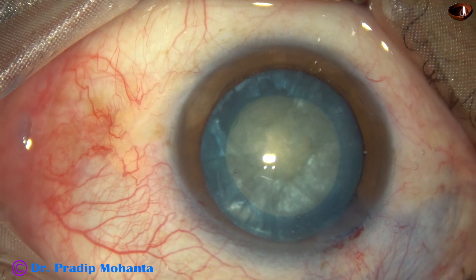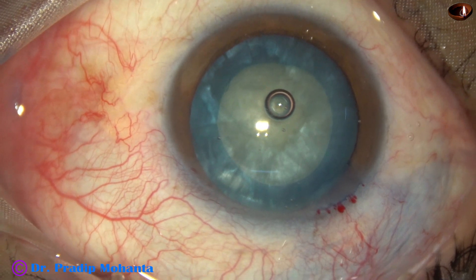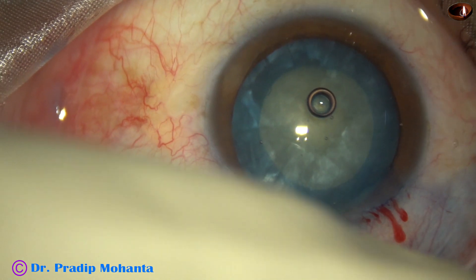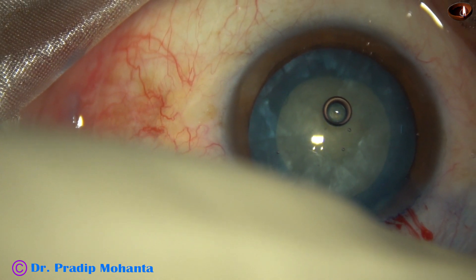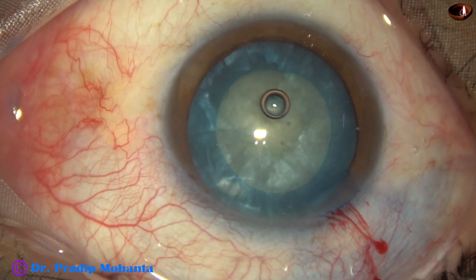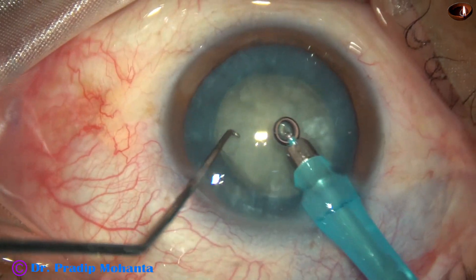This nucleus is not hard. Though it is a white mature cataract, it is not hard. Intumescent cataracts may contain a very hard nucleus, but in this case it is a softer nucleus. When the nucleus is soft, you have to take more caution to hold the nucleus and should not catch the posterior capsule. In hard cataracts, it is difficult to catch the posterior capsule, but in soft cataracts it is easy to catch the posterior capsule.